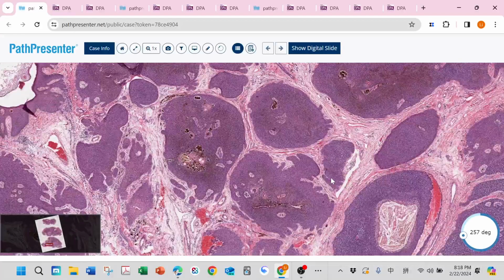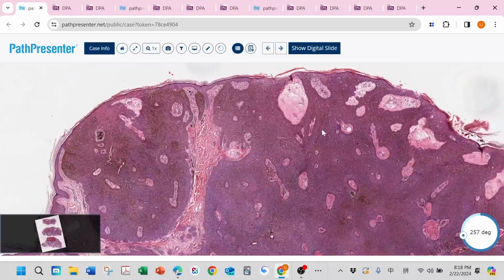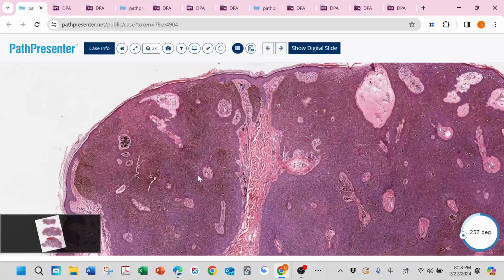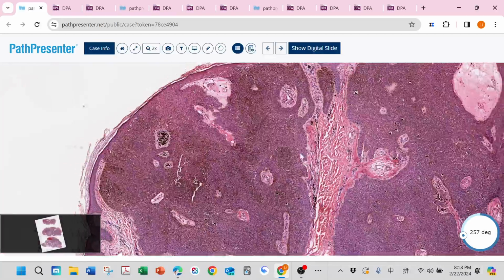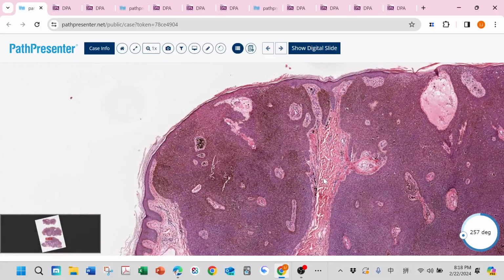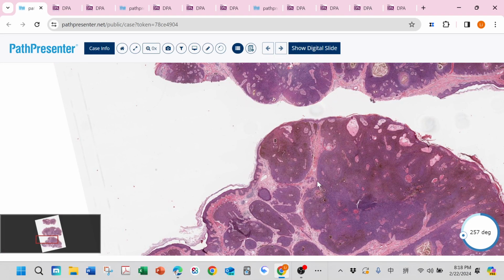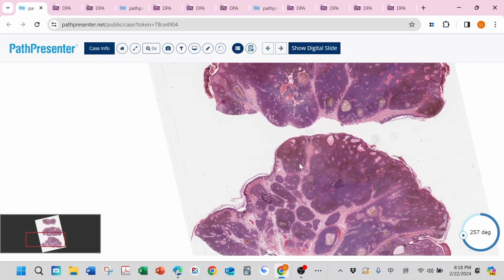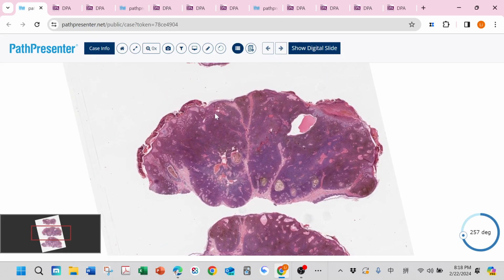But if we have multiple connections to the epidermis, monotonous cells, this poroma stroma with dilated blood vessels, this one is poroma, and combining two of these features, that is acrospiroma. But I don't think it is wrong to just call it poroma for this entity.